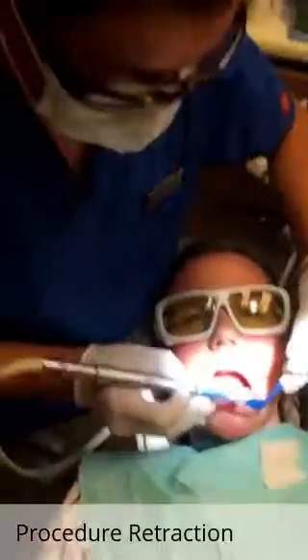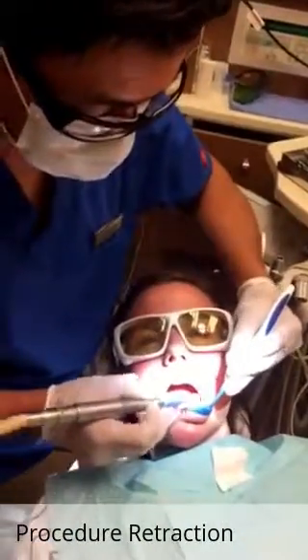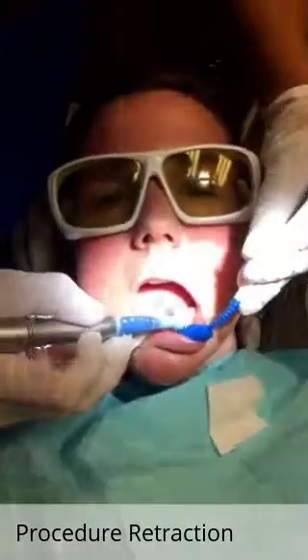The face is more comfortable with it — the lips are not usually comfortable, but something this soft the face is able to tolerate more easily.